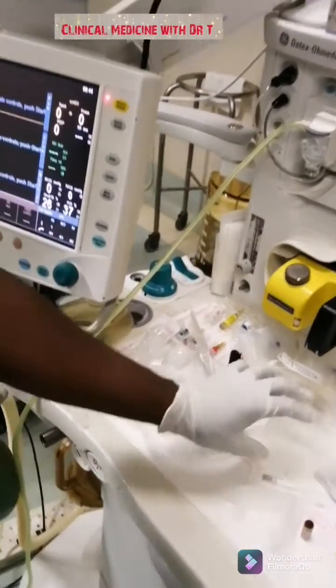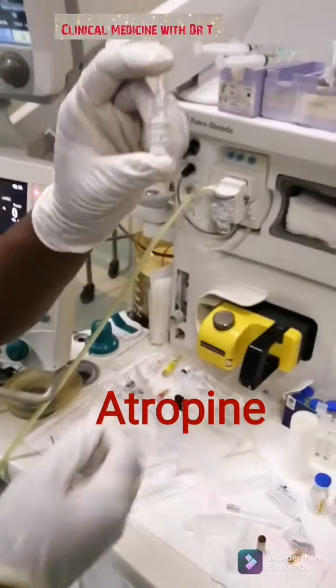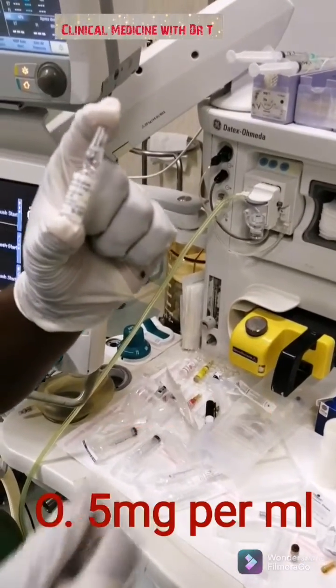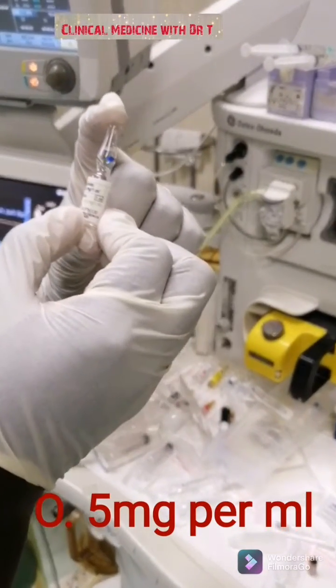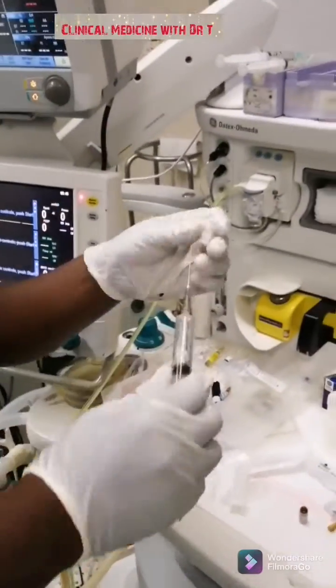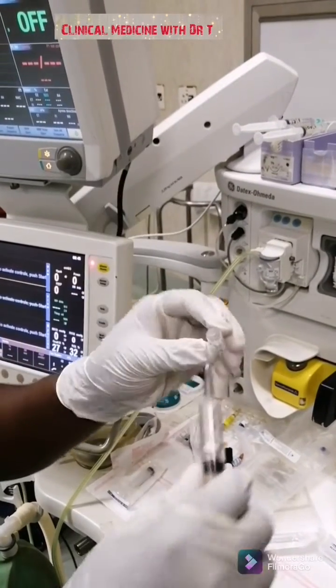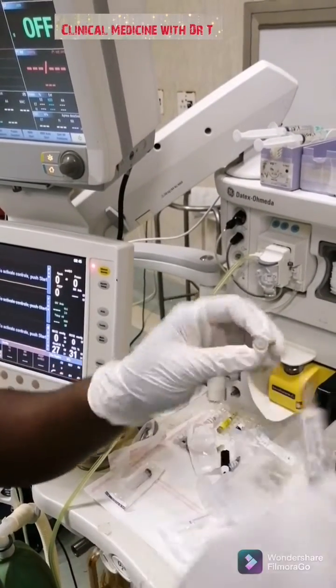The next one is atropine. Atropine comes in 0.5 milligrams per mL. This is our atropine, which is 0.5 milligrams per mL, and you draw it into a 5 mL syringe.